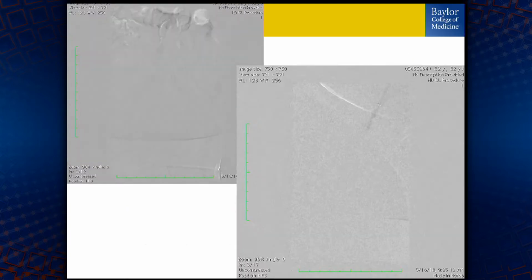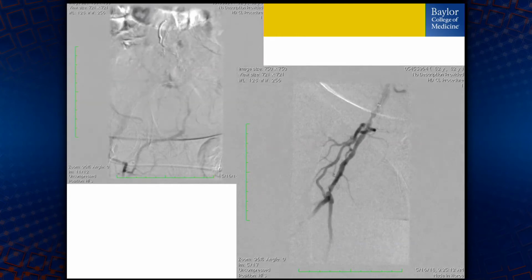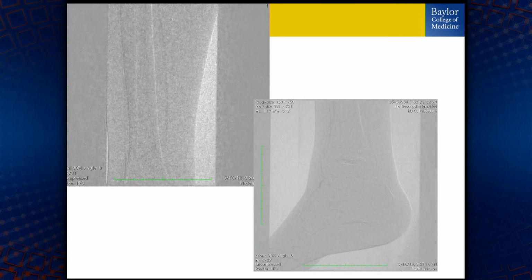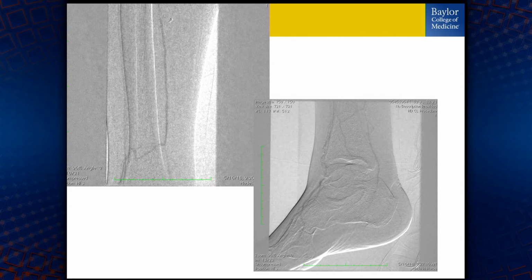Well, angiographically guided. This is a complex case in which you could see very bad common femoral, profundofemoris, and ostial SFA lesions with diffuse calcification all the way down to where there's a little popliteal. Let me go back, reverse this. Reverse one, go forward, there you go. You could see on the second image on the right, there is a very poor reconstitution of the pop and the TP trunk, and then a posterior tibial artery. Now when we followed that PT, which would have been a good access site, it seemed like it tethered into a somewhat crappy vessel.